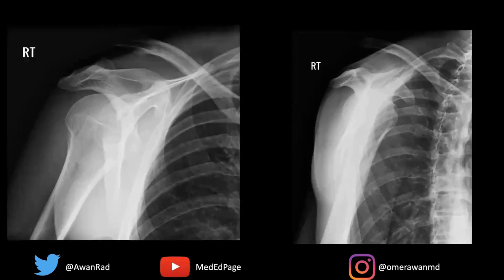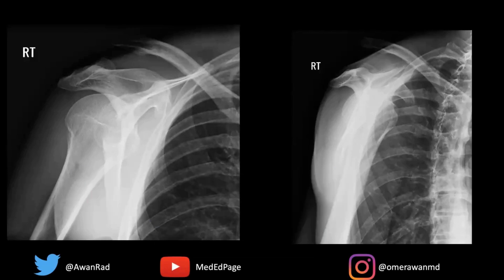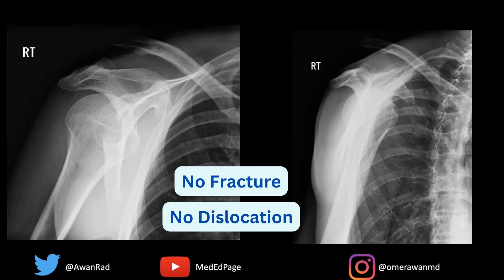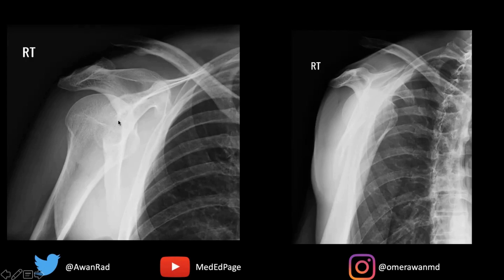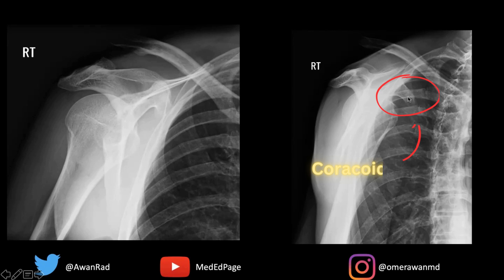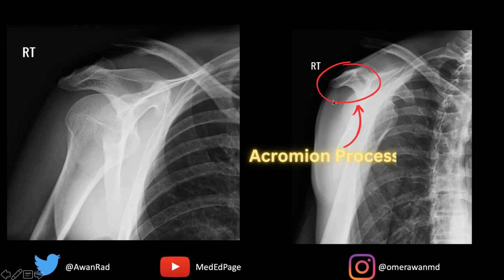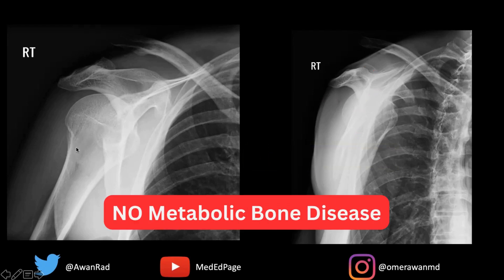If we take a look here, notice first of all that the glenohumeral joint is maintained. There's no acute fracture that we see, and no dislocation of the glenohumeral joint — the humerus is articulating well and normally with the glenoid. We see that here as well in the scapular wide view. If there was an anterior dislocation, the humeral head would be under the coracoid process of the scapula. If there was a posterior dislocation, the humeral head would be under the acromion process. We don't see any evidence of metabolic bone disease; the mineralization of the bone is adequate.